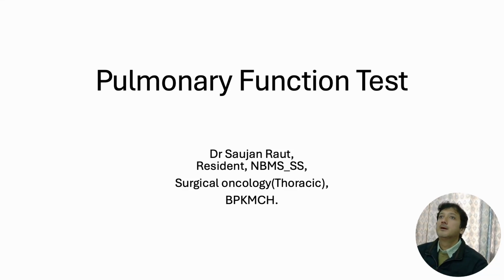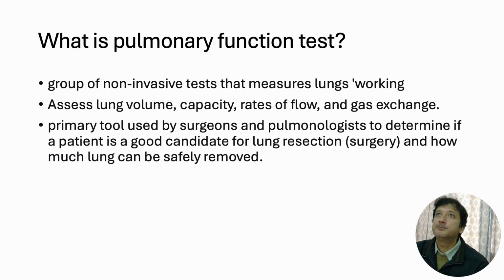Test. This is our weekly presentation. So what is pulmonary function test? It is a group of non-invasive tests that measures how the lungs are working. We usually assess lung volume, capacity, rates of flow, and gas exchange.